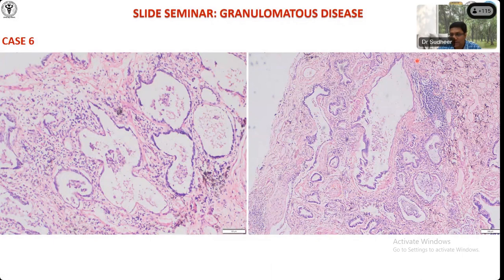thickened blood vessels, peribronchial chronic inflammation. Peribronchial chronic inflammation is again an important finding for the diagnosis, and the presence of a lot of fibrosis and alveolar destruction indicates that it is a chronic lung disease. So here till now there is a chronic lung disease with peribronchial inflammation. There are the two observations they have done, and even if you see there is mucus plug formation also, that is impairing the mucus clearance. Again, complication. Thick walled blood vessels. Again, can you see this? This is the bronchi where there is proliferation of myofibroblasts here. That I will show you in the next slide.